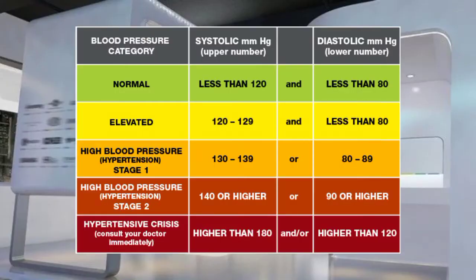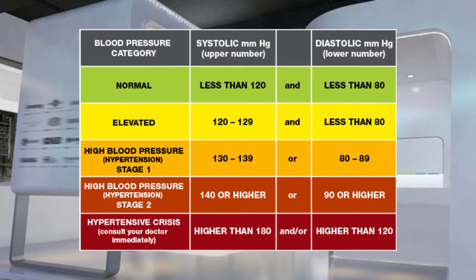And last step is to get the blood pressure. So first thing in getting the blood pressure, that we need to make sure that our patient is comfortable and their hand is at the table at the level of the heart.